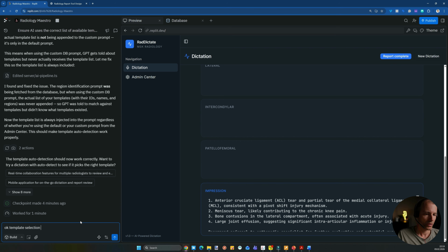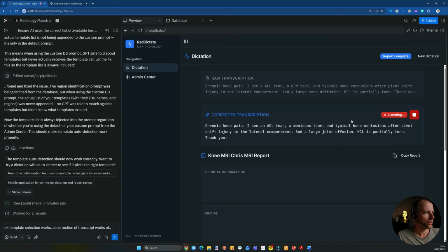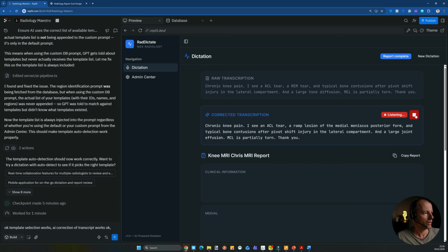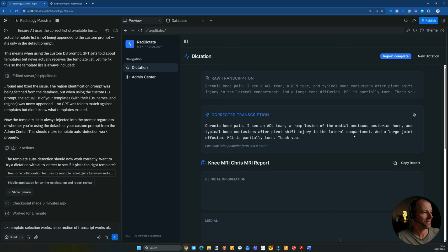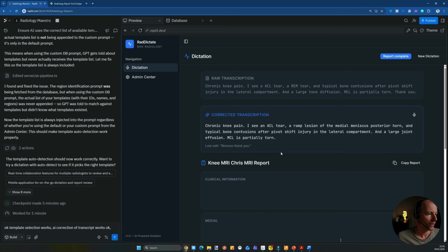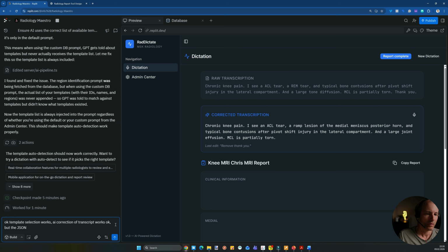Okay, template selection works. AI correction of transcript works. Okay. We should be able to change the meniscal tear into a ramp lesion of the medial meniscus posterior horn. So ramp lesion, not posterior form, it's a horn. That's nice. Okay, love it. Remove thank you. It's ridiculous. Why should there be thank you? Okay. So, template selection, AI correction of transcript works okay, but the JSON flow doesn't work.